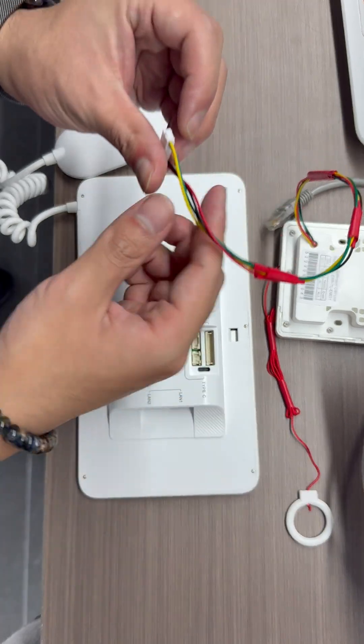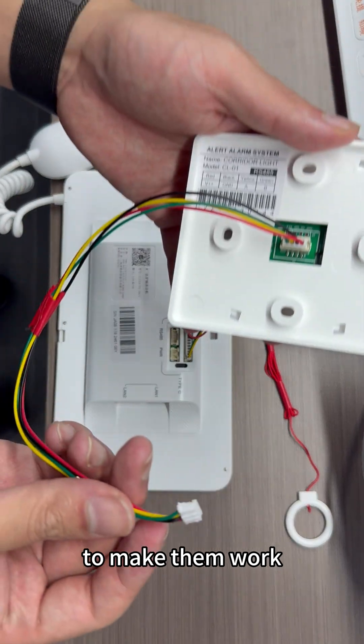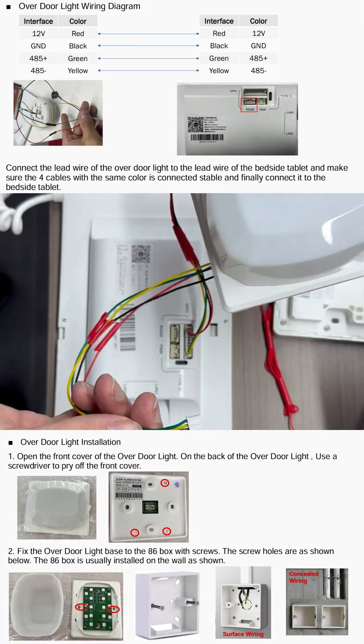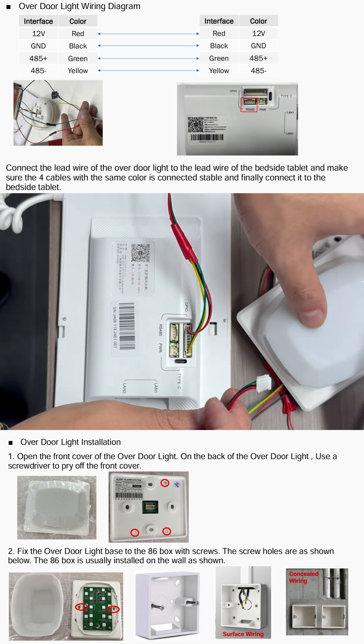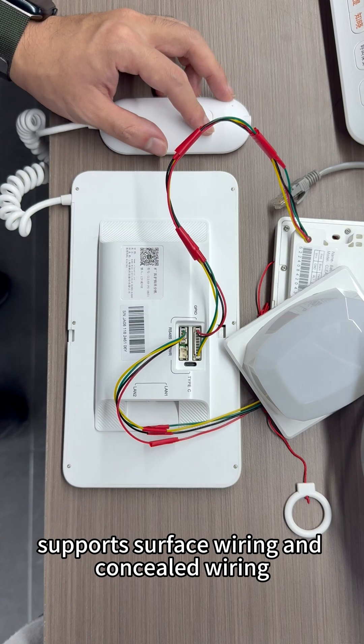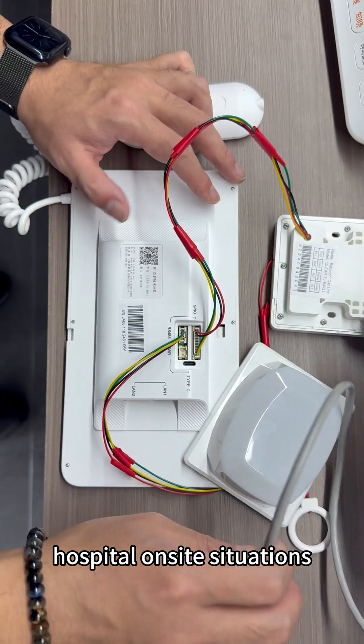Use the RVV cable to connect them based on the situation on site to make them work. The bathroom call unit and over-door light support surface wiring and concealed wiring for different hospital on-site situations.